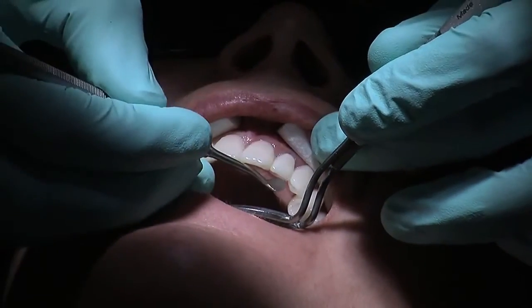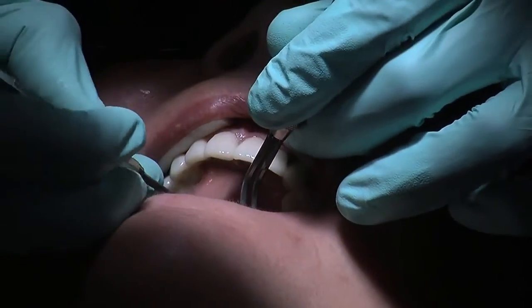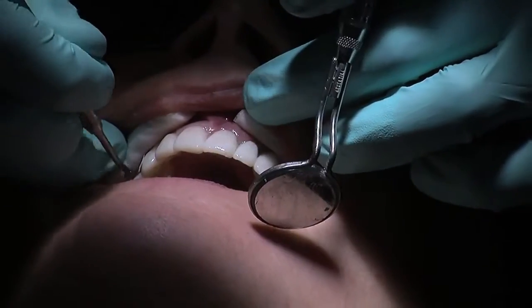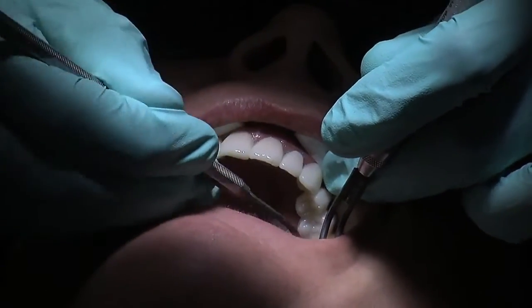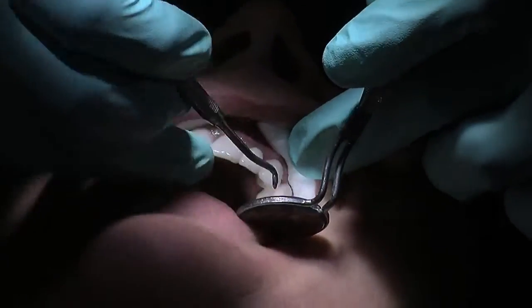So I've got a Mitchell's trimmer here, and I'm just going to be removing any slight bits of excess flash of the Luxatemp. And really, this is beautiful. There's very, very minimum amounts. Also, you've got to look out for the occlusal surfaces of the last teeth, the 6s. There's normally some on there, so just remember that for the occlusion checking later.